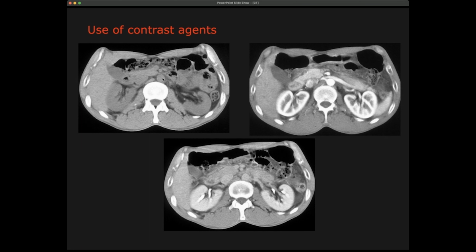This is a large blood vessel, and this is actually the aorta, because we know the aorta comes out of the heart, your main large artery, goes up, makes a bend, and then goes down by the spine. So besides the spine, we have a large blood vessel that goes from the top of your body to the bottom of your belly. You see the blood in the aorta has a very similar attenuation coefficient as tissue, so you can't discriminate these.